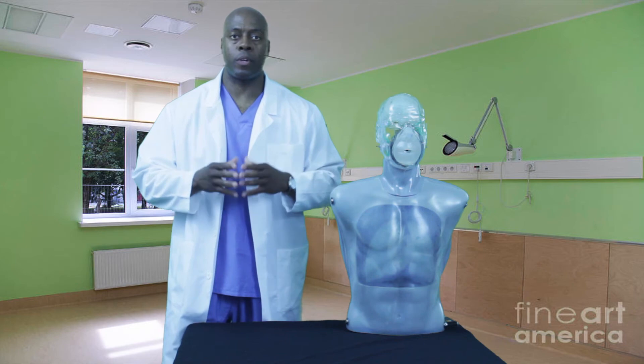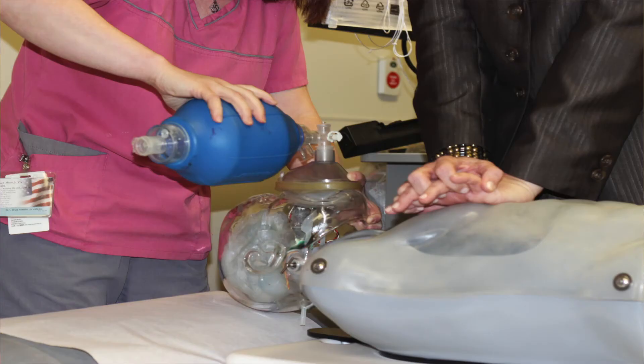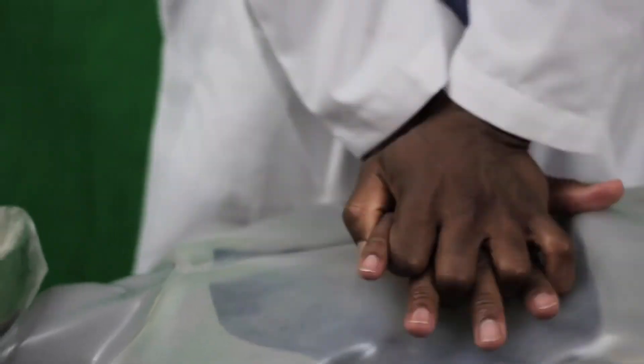We now know with the current guidelines that chest compressions are the most important skill in CPR. One of our measurements was to detect the correct depth and rate of chest compression, accurately done by using a computer metronome.